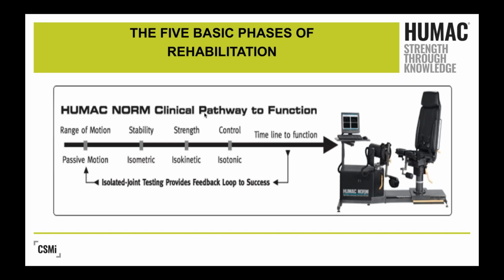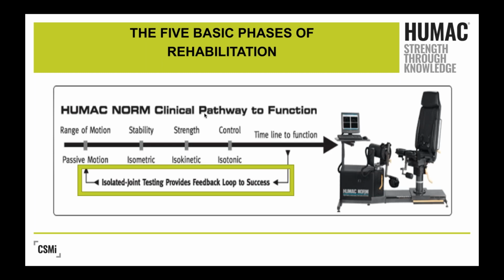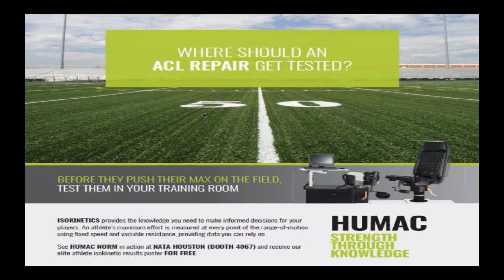All right, so again today and in the next month, we're going to talk about isometric and isokinetic testing, and that's going to complete our continuum of care loop. So this is a poster that CSMI came up with a few years ago. And this sets up the presentation perfectly.